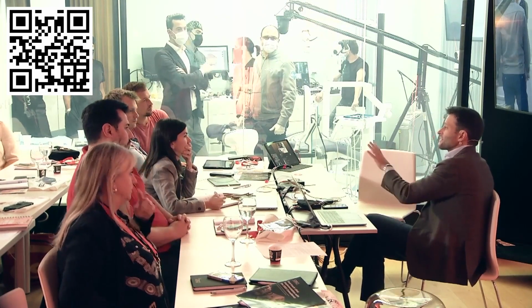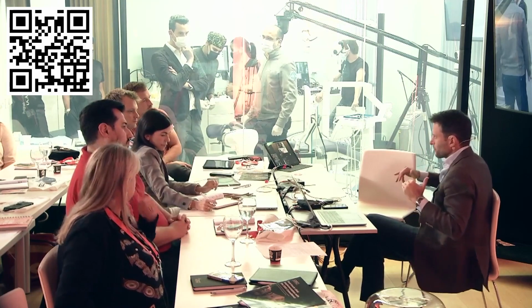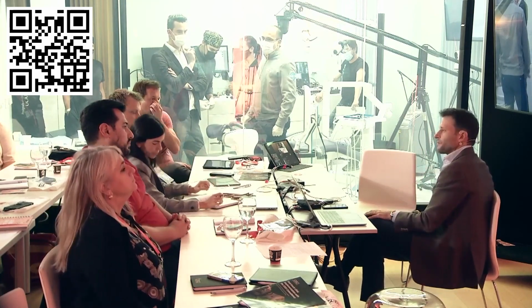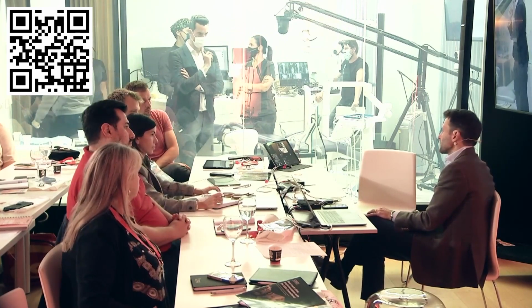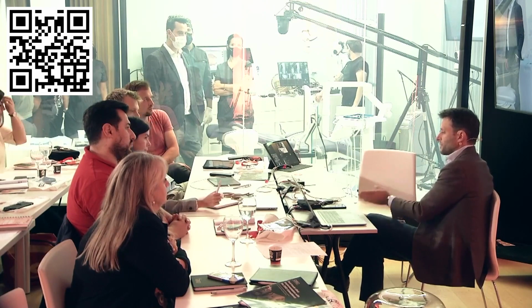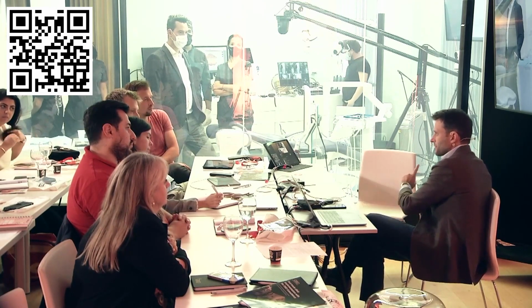Let's say there's an aesthetic problem, the midline or occlusal plane or something is wrong. First, we need to think about why it's wrong, because we did the design in 3D. Was the design off, or maybe we didn't notice that problem on the facial picture? So anyway, what you need to do is redo the 5 pictures with the patient with the bridge.